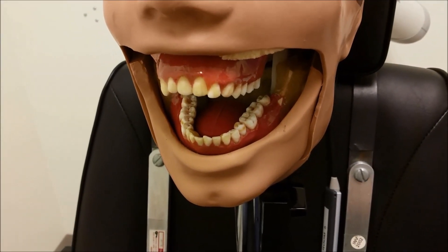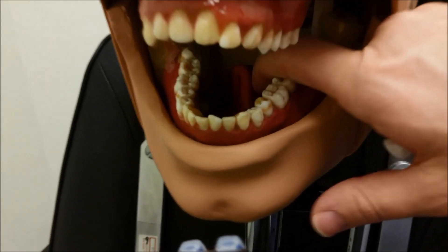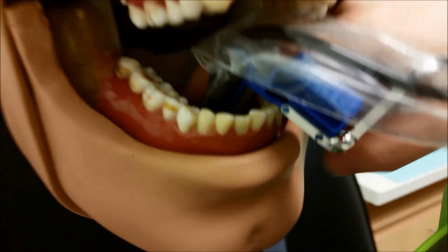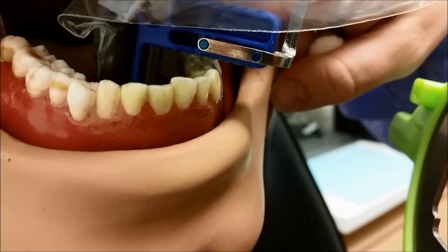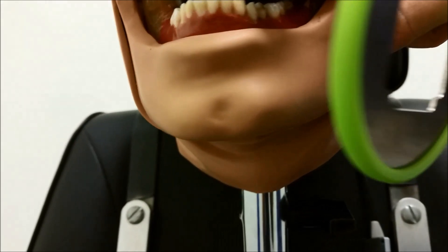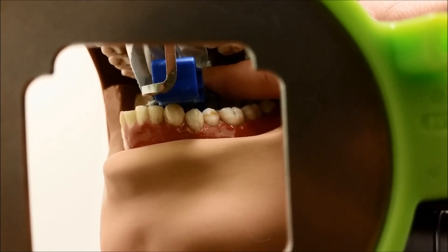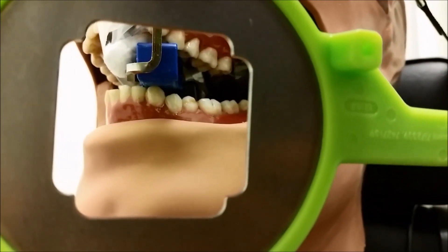Now we're going to do our anterior mandibular canine first premolar image. Make sure to move your tongue back to make way for the sensor. Coming in at a little bit of a negative angle will help you get some placement. Try to center the contact between the canine and the first premolar on the bite block. Aiming between the canine and the first premolar, place a cotton roll, and bite down.